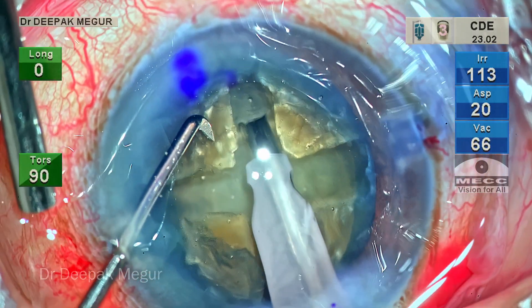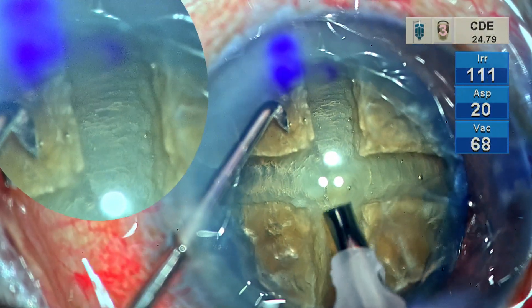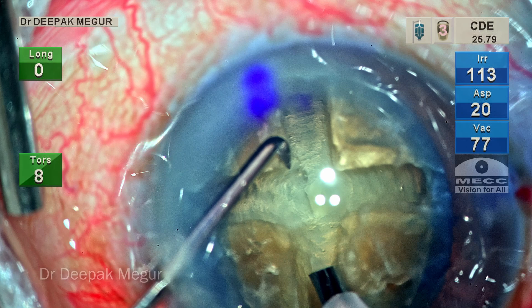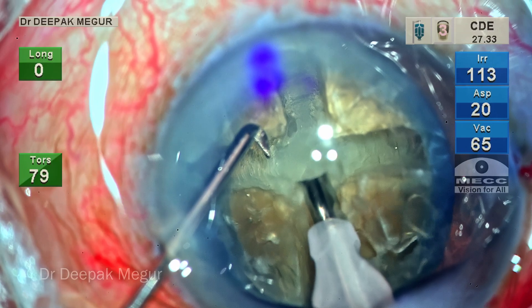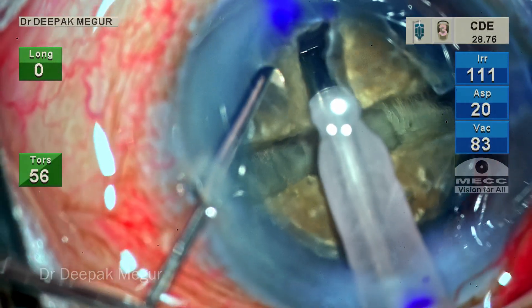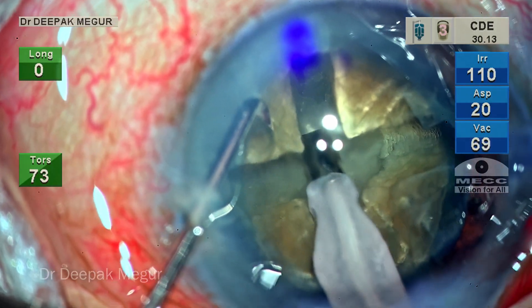The grooves are progressively deepened. At this stage in the groove, you can see horizontal striations of the lens fibers, which are very much visible. As I grow deeper than this, the color of the lens undergoing sculpting suddenly changes. The nucleus is rotated, the grooving continues, and as sculpting becomes deeper and deeper, we reach a point where the horizontal striations of the lens fibers just disappear.